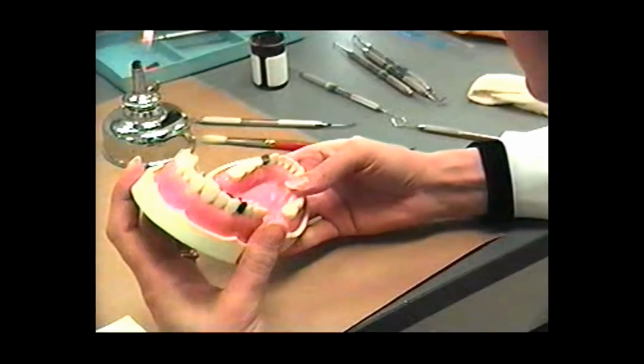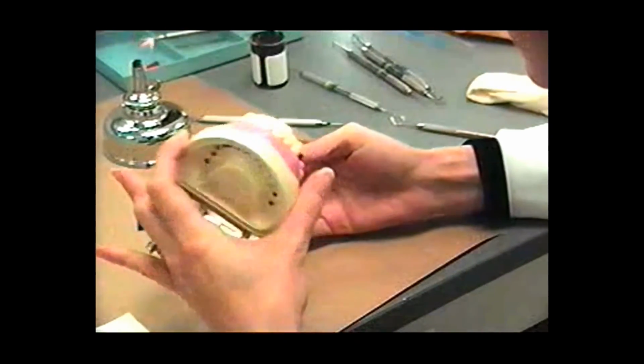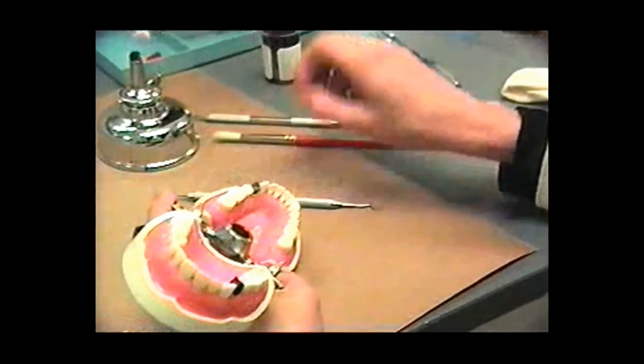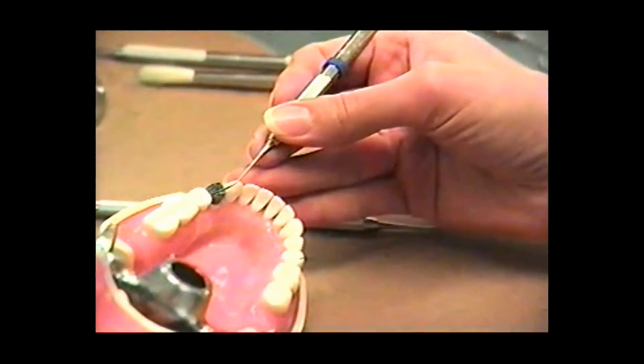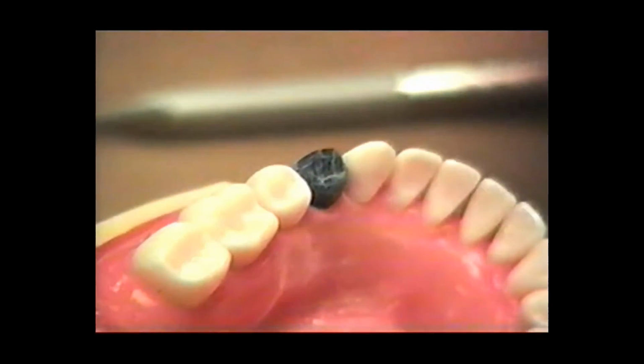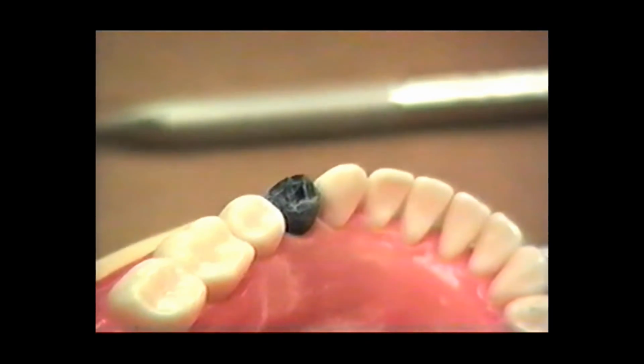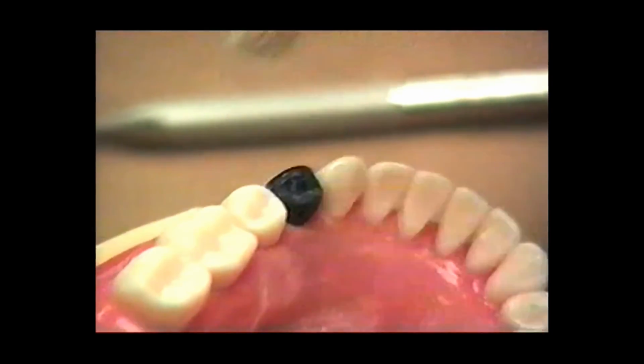Squeeze and check again. Here we go. We've got our contacts right where we want them to be. Got a distal marginal ridge contact. We've got a cusp ridge contact, cusp tip contact. Still getting a triangular ridge contact. We'll take that down. Now the next thing we do is we want to polish this.